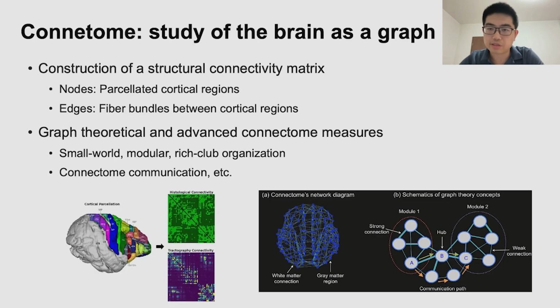Quantitative measures computed from individual fiber bundles can also be used to construct a structural connectivity matrix to map the whole brain structural network between all pairs of gray matter regions. This approach is motivated by a general shift of the focus away from the role of isolated regions towards understanding the brain as a network system.